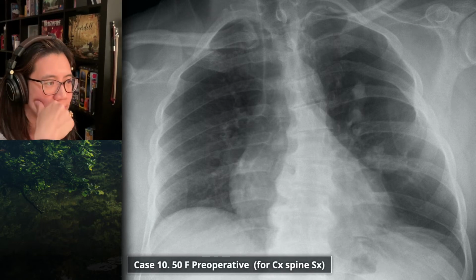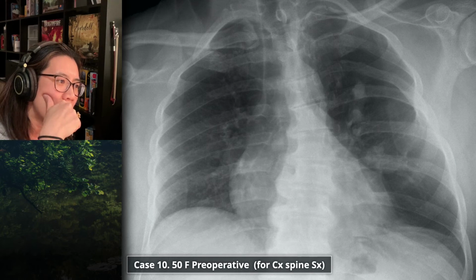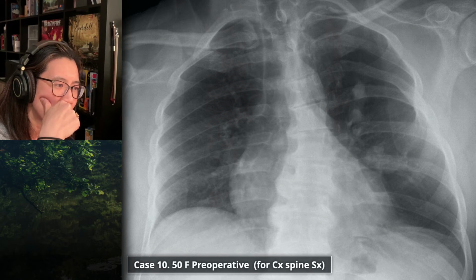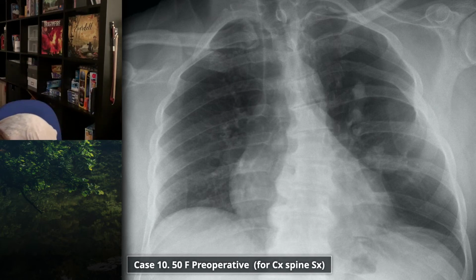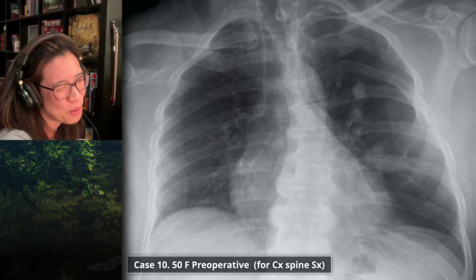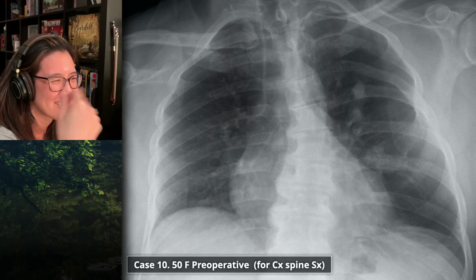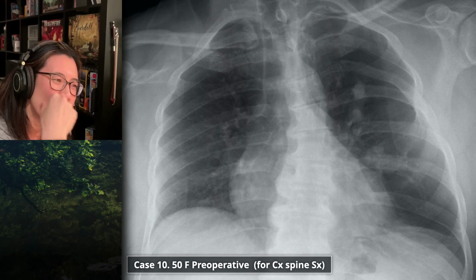What vessels are they that you're seeing that are too big, do you think? I think they're probably pulmonary veins. And the reason I say that, does that make sense? It doesn't really make sense, actually. I take that back. I think they're probably pulmonary arteries. That doesn't make sense either. Unless there's a big central pulmonary embolus or something that's expanding the vessels. How about aneurysms?